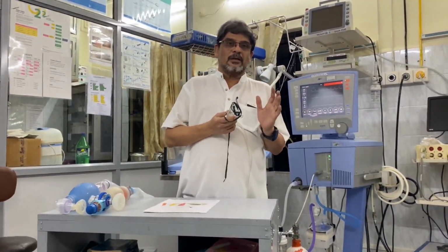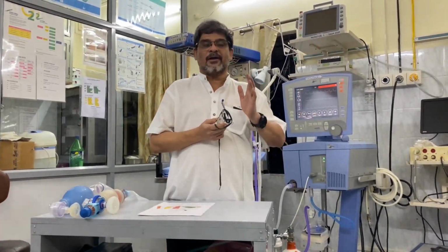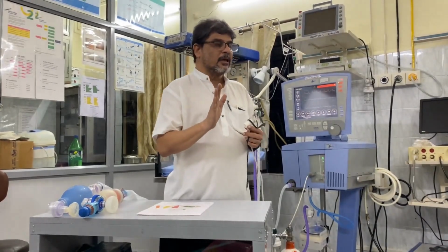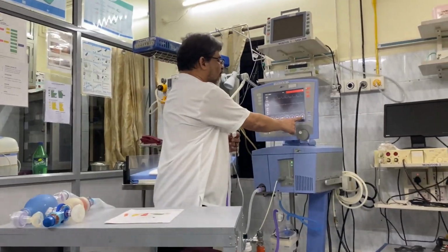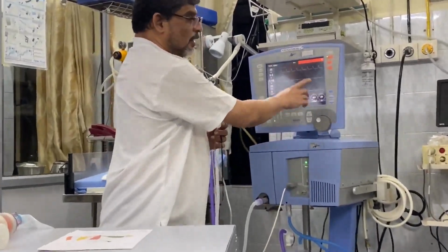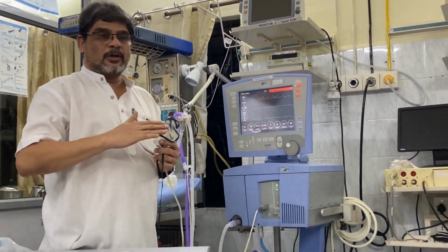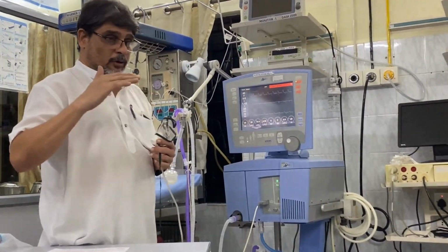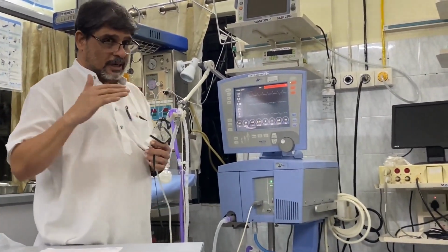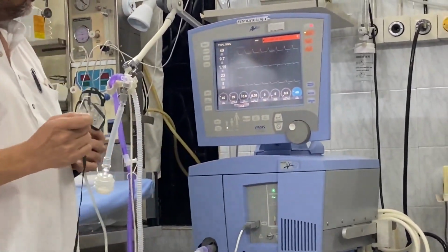So oxygenation is mainly a function of mean airway pressure and FiO2. These are the two things which will decide your oxygenation. If you keep on increasing FiO2, that is the percentage of oxygen delivered to the patient, your oxygenation will improve, your diffusion of oxygen will improve, and the oxygen content of the blood will improve, or your saturations will start improving. That is one, by increasing FiO2. That is the easiest way to improve.